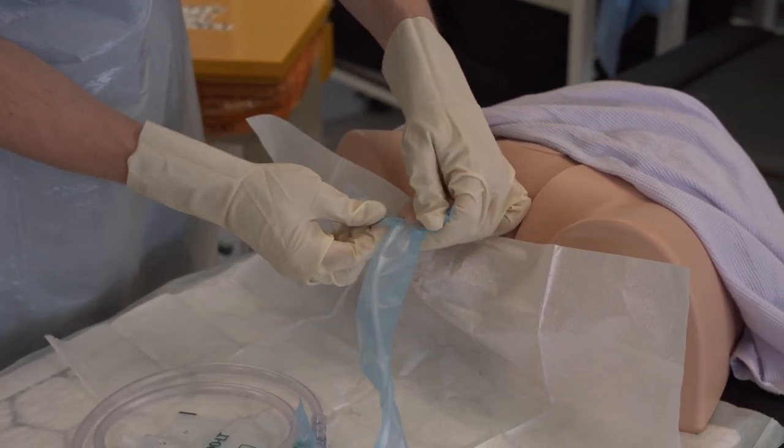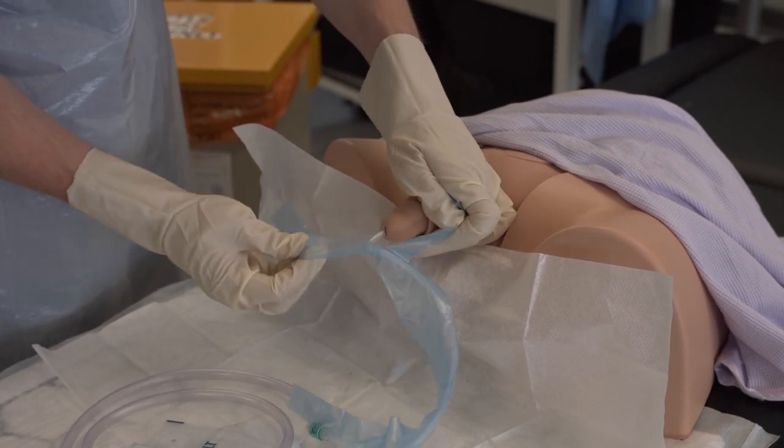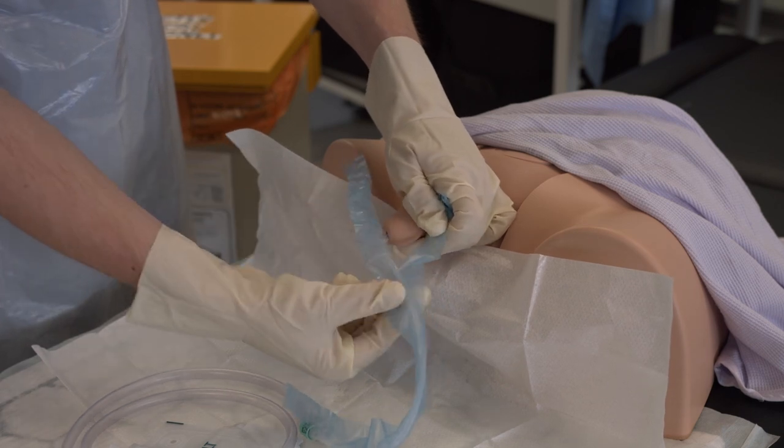Grasp the penis with your left hand and insert the tip of the catheter into the urethra. Rip open the perforated bag as you go, ensuring you are touching only the perforated bag.